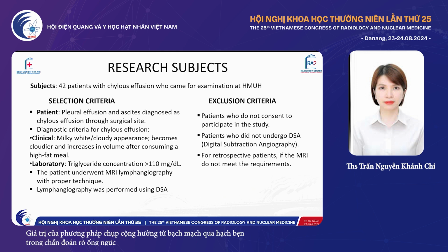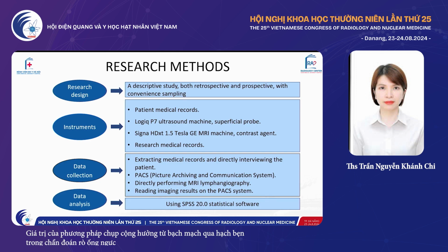Our study includes 42 patients with chyle leakage who visited our hospital. The selection criteria are patients with chyle leakage diagnosed both clinically and by laboratory tests, and who underwent MRI and DSA of the lymphatic system. This is the research method.